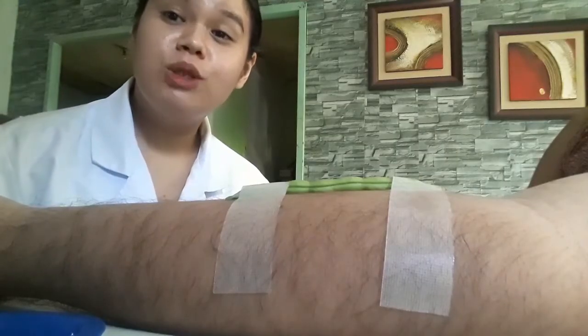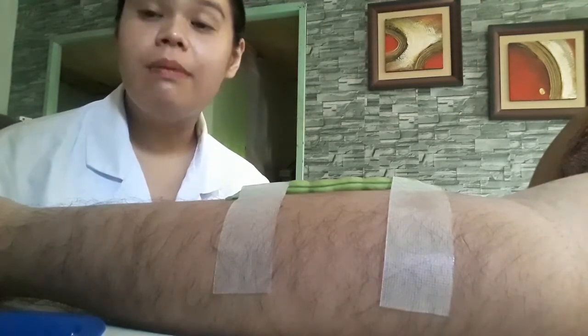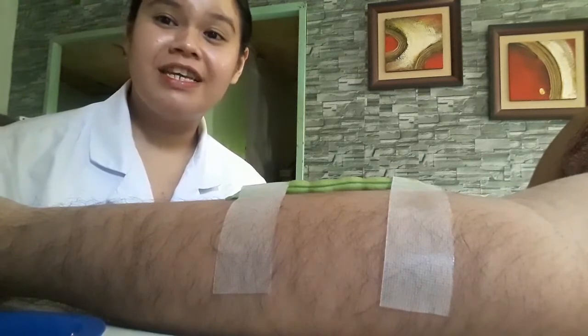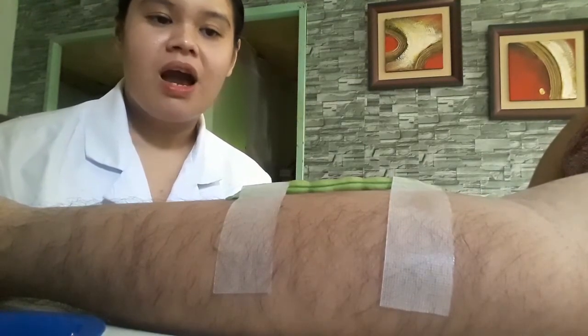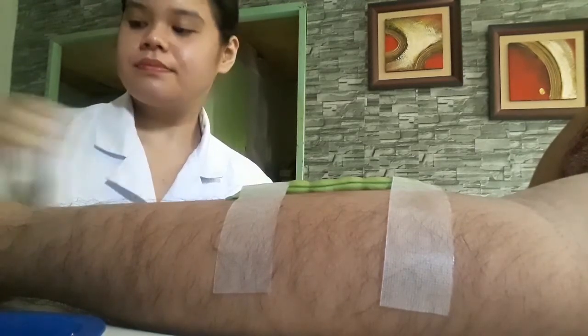Encircle the wheel with a blue or black pen and instruct the client not to rub, massage, or scratch it, or any other things that might cause discomfort about the medication that was injected earlier.